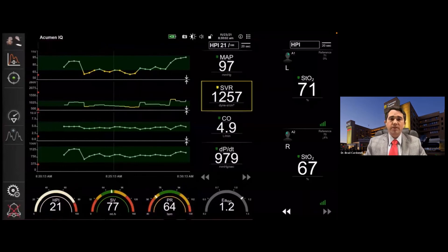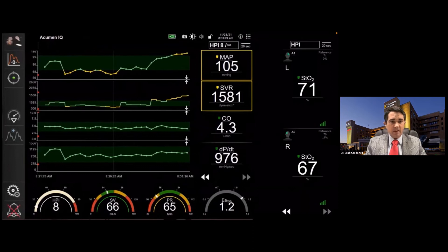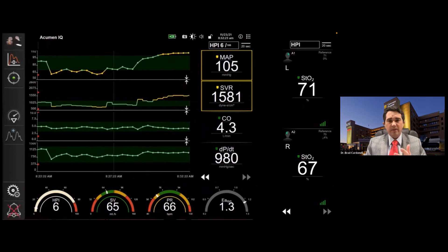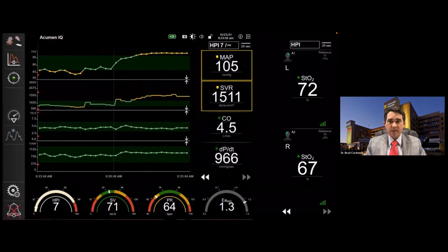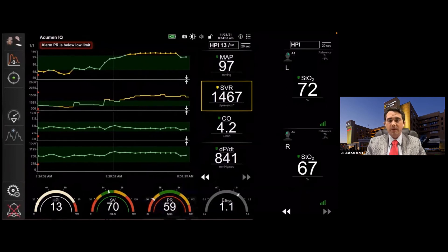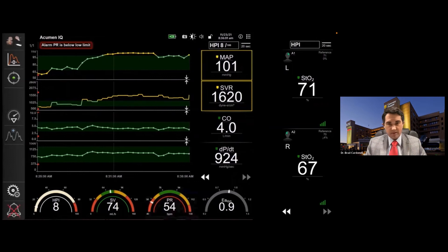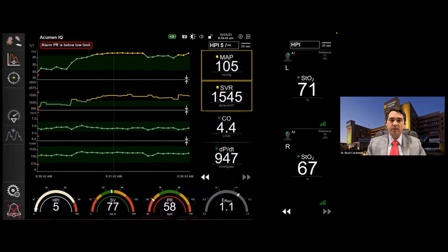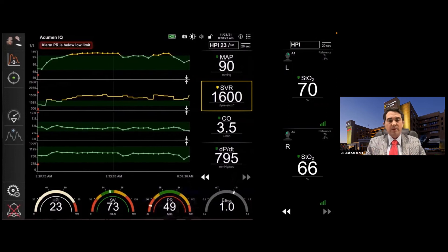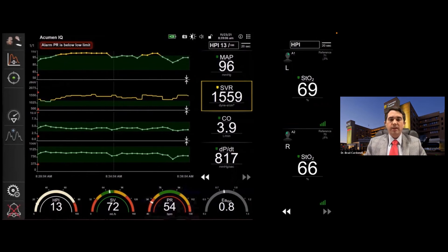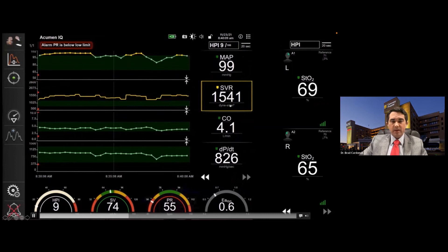This is an extreme example that brings it all together with NIRS cerebral oximetry. We know low blood pressure is bad — this is an example from one of my partners where we recreated the simulation to show what was really going on. This is an off-pump CABG with EF around 25-30 percent, during heart manipulation. We know during these cases we have to support blood pressure — the heart is placed in the most abnormal, unphysiological position. In this situation, we were correcting with vasopressors, which is common with off-pump CABGs, but now with all the parameters it showed me more of what we were doing to some of these patients.